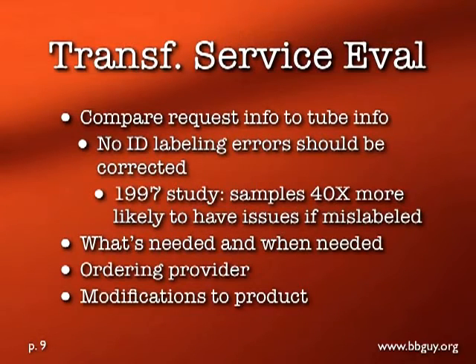Once the sample gets to the transfusion service, then the transfusion service has a job to do. Basically, they have to first compare the information on the request to the information on the tube. And I mentioned this before. It's got to match. It's just that simple. It has to match. And I'm very serious about this. I am incredibly strict about this, and it's not always the most popular thing in the world, I'll tell you that right now, but I require redraws if there's any discrepancy.